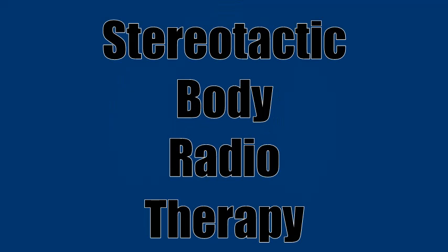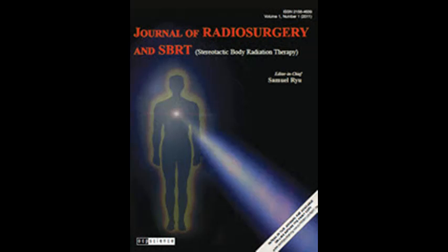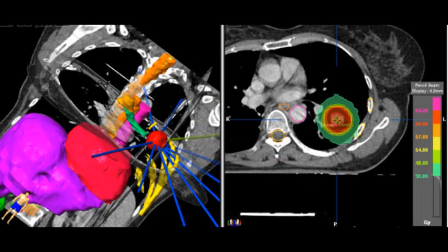Well, number one, we should talk about what is SBRT. What does the acronym stand for? It stands for Stereotactic Body Radiotherapy. And the stereotactic piece of the puzzle is talking about specifically the precise nature of it. So compared to conventional fractionated radiotherapy, the margins are much more tight. So say instead of a 5 millimeter margin, it might be a 2 millimeter margin, maybe a 3 millimeter margin.